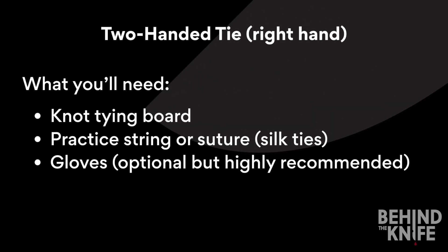Today we're going to learn how to do a two-hand tie. For this we'll need our knot tying board, our practice string, or you can use suture. Silk ties work best. Gloves are optional, but I highly recommend them.